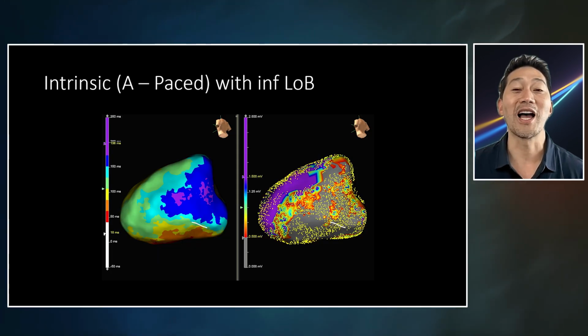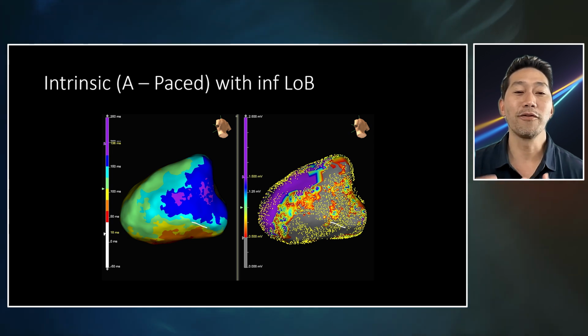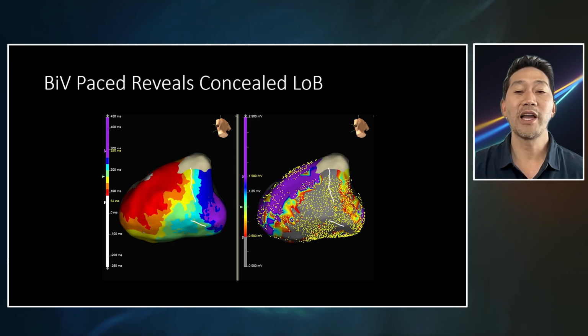What we did was we did a high resolution map, and here you can see structure and function. Function on the left with an isochronal late activation map, looking for areas within that low voltage, which is quite non-specific, of deceleration zones. And here you can see a white line indicates a region where there's more than 3 colors of crowding. And these are potential regions that are actually indicative of lines of block.